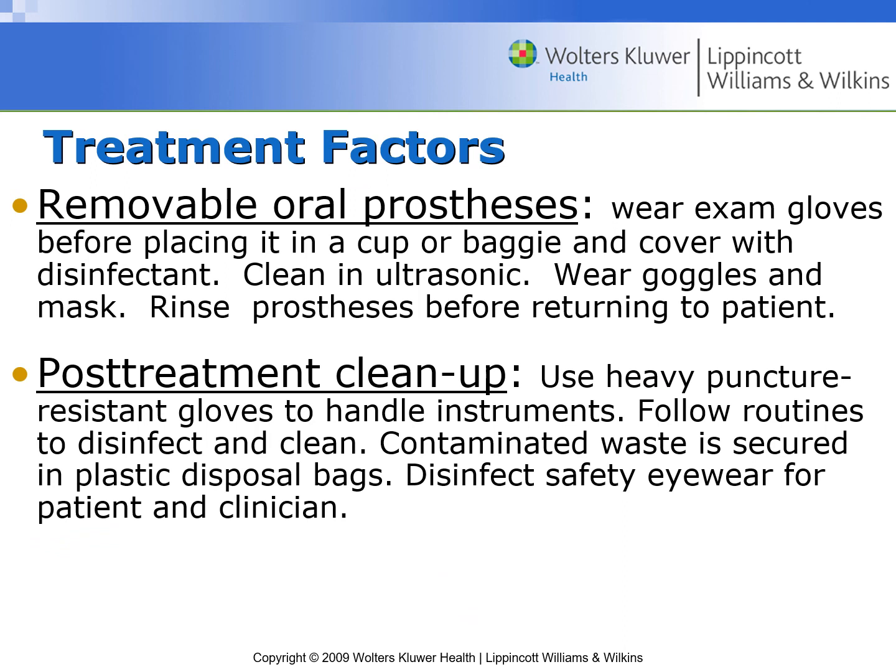Treatment factors, removable oral prosthesis. You need to wear exam gloves before handling. If someone takes out a partial or a denture, place it in a cup or a baggie and cover it with disinfectant, which you will be shown in the sterilization part. You need to clean it in the ultrasonic. You wear goggles and a mask always while you're doing that, so that if the ultrasonic splashes, it does not get in your eyes and mouth.